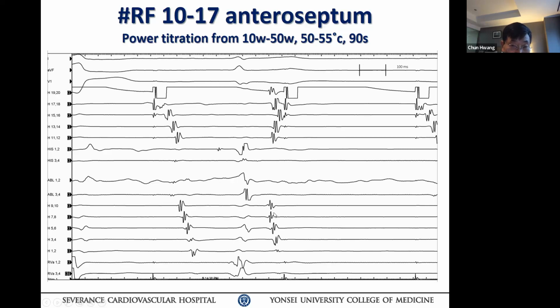Subsecond, you pace faster. Make sure that you're not injuring the AV node, because you're ablating anterior, even though it's far away fluoroscopically. When you see even one single junctional beat, you can tell, sure, stop burning, pace, and burn again during the A pacing faster. Make sure you don't see any junctional suppression, watching the PR interval. Otherwise, you can have heart block. That's the recommendation. Okay?